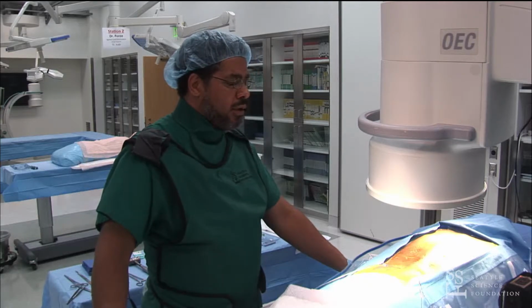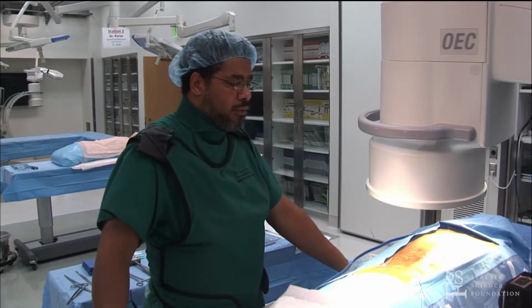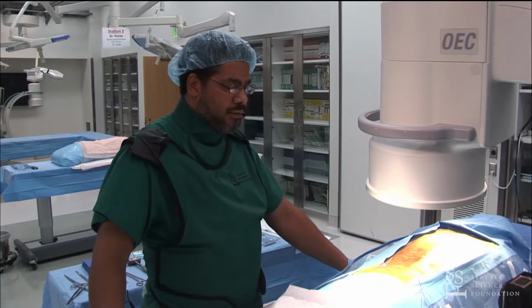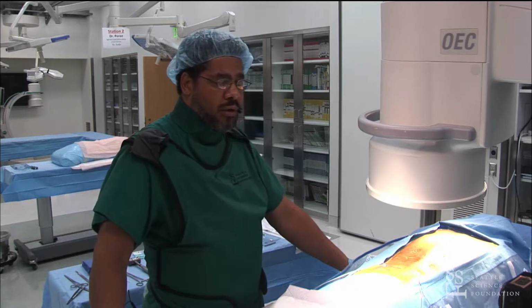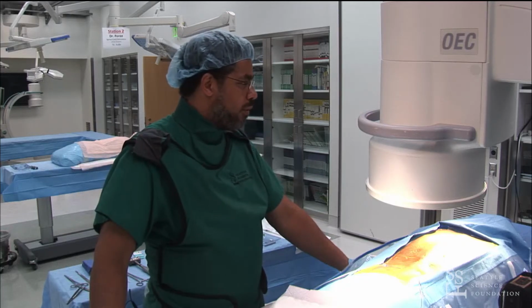And so certainly with the dorsal root ganglion stimulation, the loops that you see here might migrate, so half of that loop might pull back, but that's why we put the loops in to allow for that flexibility, but the leads themselves usually stay in place. Very little. So in both cases, I'd say about the same amount of migration rate with the current non-sutured DRG leads as well as the anchored spinal cord stim leads. Both have similar sort of migration rates.